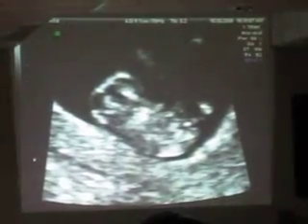Where I will get myself alerted, where I will hesitate to change the dates, is in a patient with pre-gestational diabetes, uncontrolled, who comes in early pregnancy. Then I do the CRL, it is not corresponding, and she says she's really sure of her dates. I will hesitate to change the dates because in pre-gestational diabetes, an early growth delay actually means a major structural abnormality which is going to develop later on. If she is not a diabetic, then my first choice will be changing the dates and then we will watch out.